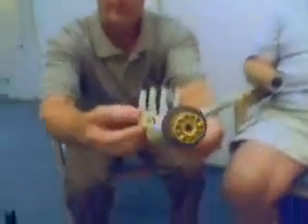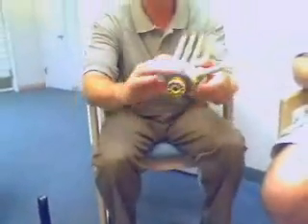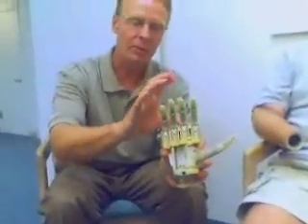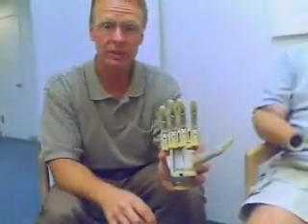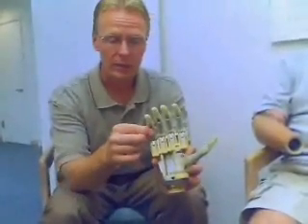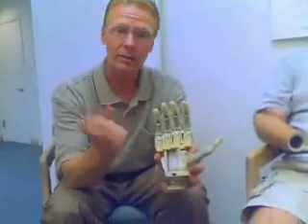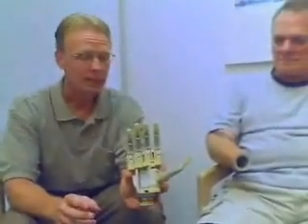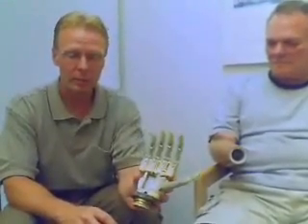The hand itself is a chassis for the digits. Each digit is screwed into the chassis — it does have a little screw there. What this allows the hand to do is individually change the digits. If one of the digits is broken or damaged, they can be popped out and another one replaced, so the patient doesn't need to send the hand back. They can leave, and then the digits return to Touch Bionics, and we will repair it.